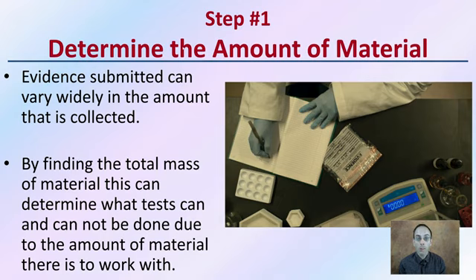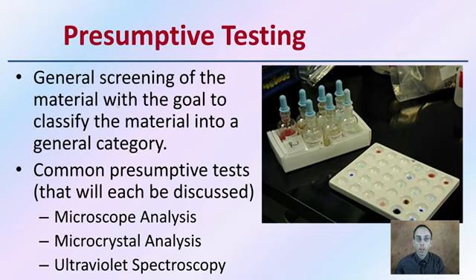But this isn't always the case. You want to make sure that you're only collecting the isolation of material. You don't want to have other contaminants in there. This is why more is not always better. But the amount that you can collect will limit or potentially determine what tests will be carried out from there.